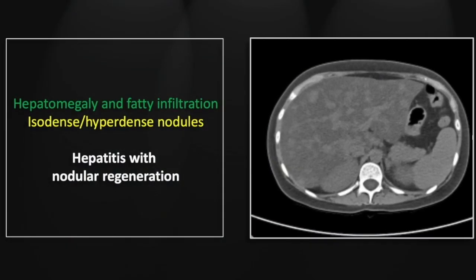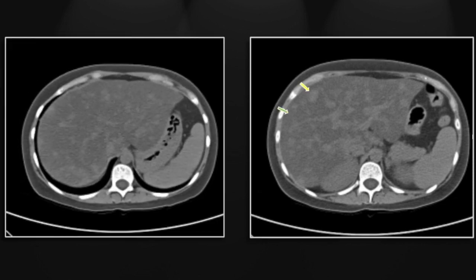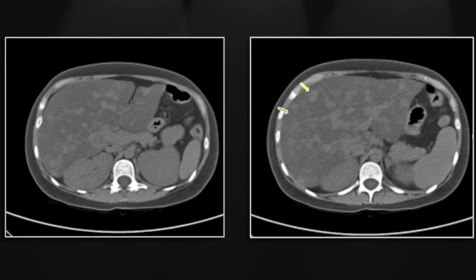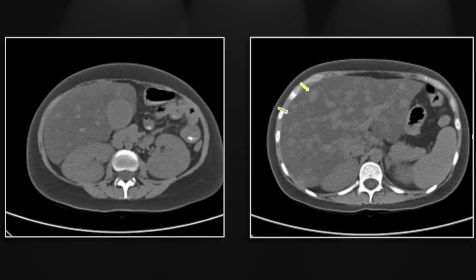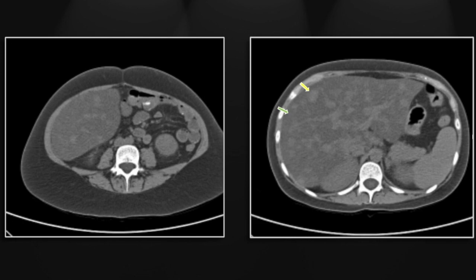Our next case is hepatitis with nodular regeneration. You can certainly appreciate the hepatomegaly as well as the extensive and pronounced fatty infiltration. There are also numerous isodense and hyperdense nodules throughout the liver, consistent with nodular regeneration. You can see the marked fatty infiltration and the massive enlargement of the liver, which extends well down into the pelvis.